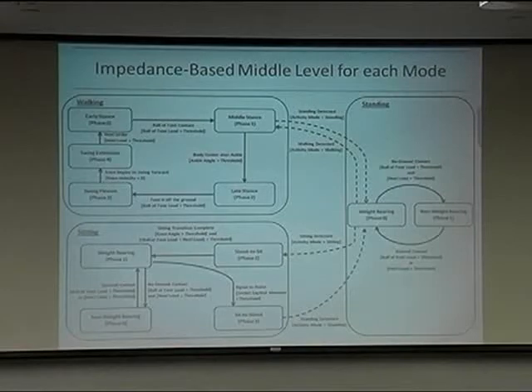But all these things have come together, and so it's kind of exciting for somebody who does what I do, because it enables really a lot of new things. The battery we're using is called a lithium polymer battery. Ours weighs about 1.5 pounds. It's one of the heavier components in the leg, and it's embedded inside the structure of the leg. You have to take off an aluminum cover in order to get to it. So it's kind of part of the structure.